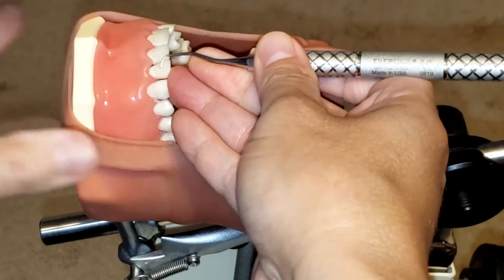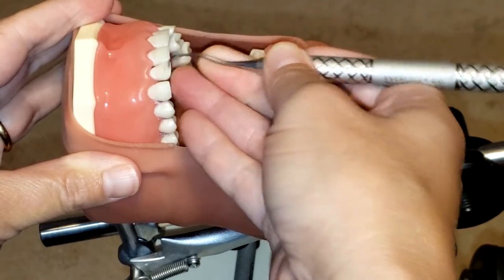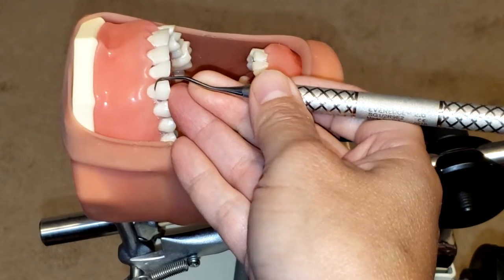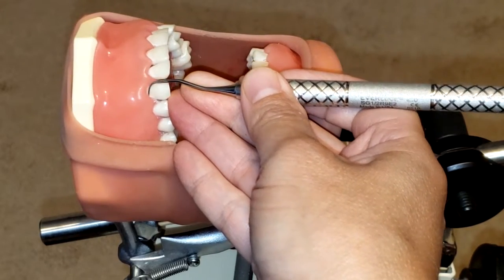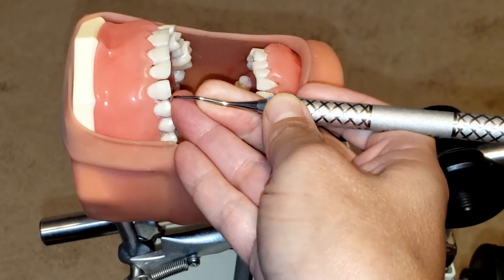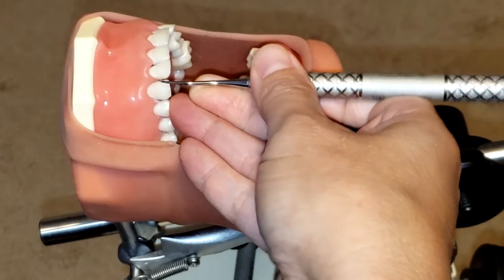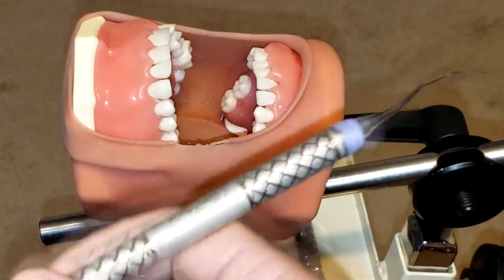When the instrument is placed in the mouth, you want to make sure it is pointing towards the area you're working on. Because this instrument only has one cutting edge per side, you'll need to flip the instrument for anterior teeth. You'll start at the midline and work your way towards the distal, then flip and start from the midline working your way to the mesial of the tooth.